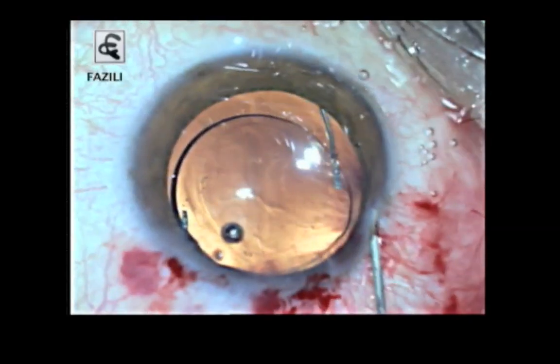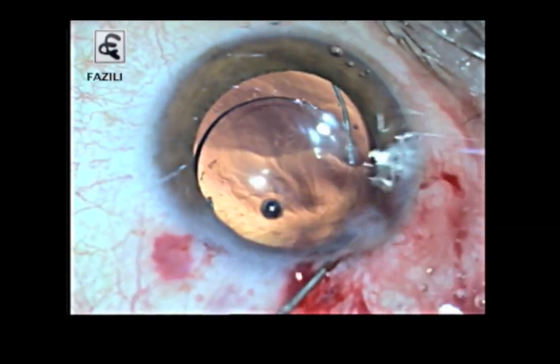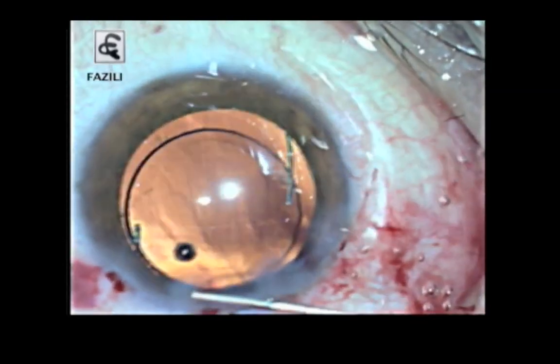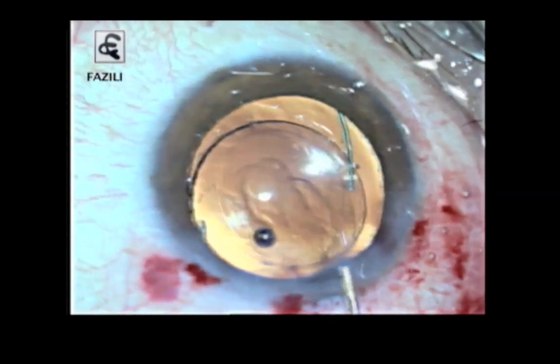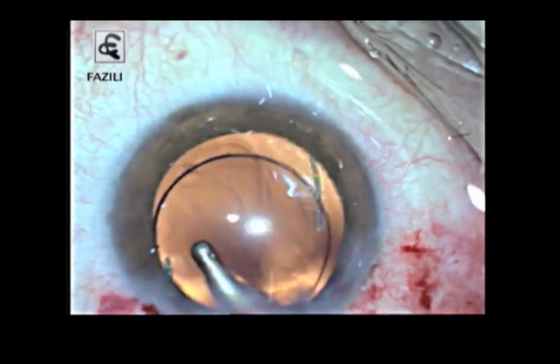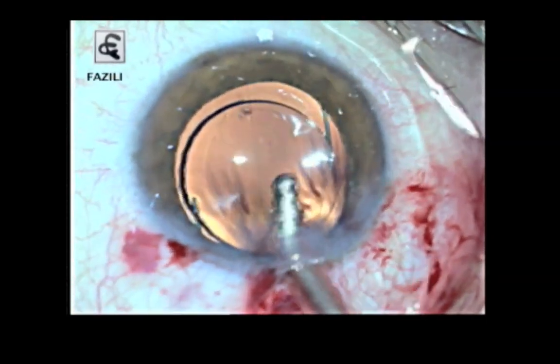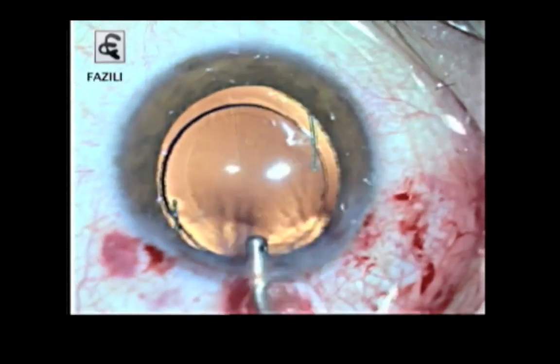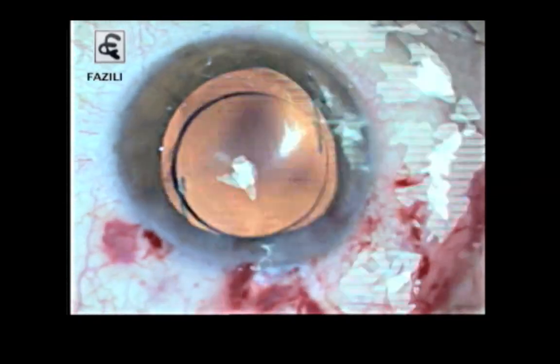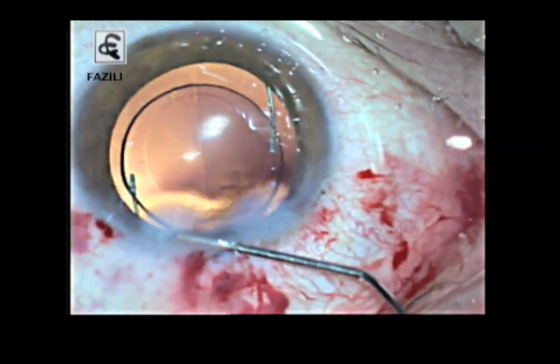You can see a minus 5 IOL has been implanted, and very easily, because now the size of the rhexis is good. And you can see I'm doing stromal hydration a little bit before the IA probe goes inside to remove the viscoelastic. That gives us an additional edge of controlling the fluctuation in the anterior chamber. Then while you're coming out, leave it there. Now complete your stromal hydration nicely.